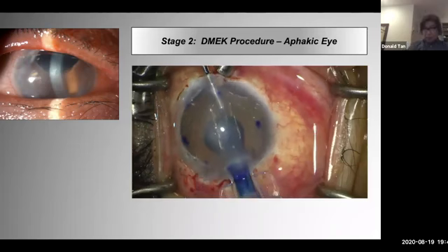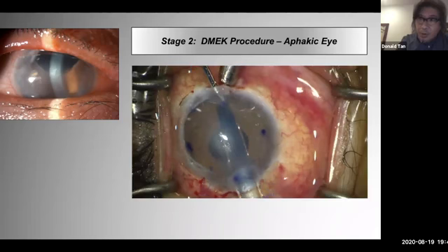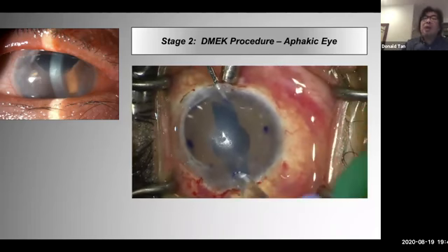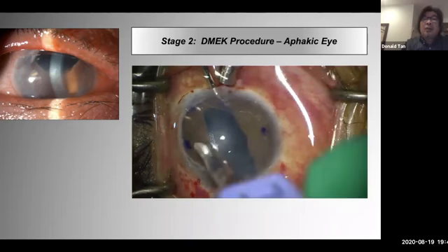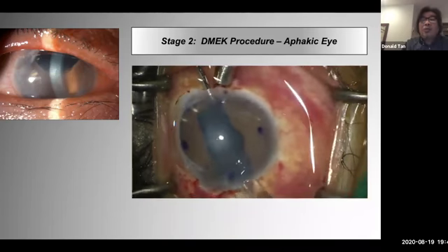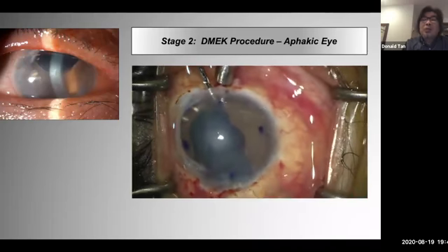So you will find this boring by now, but as surgeons, we like boring. We don't want nasty surprises. And what this does is it makes DMEK boring, which is just fine. Okay, so no nasty surprise, or less anyway. You know, here I'm just tapping the wound, it just closes, deepens the chamber a little bit. So you can still modify the chamber position with this iris.